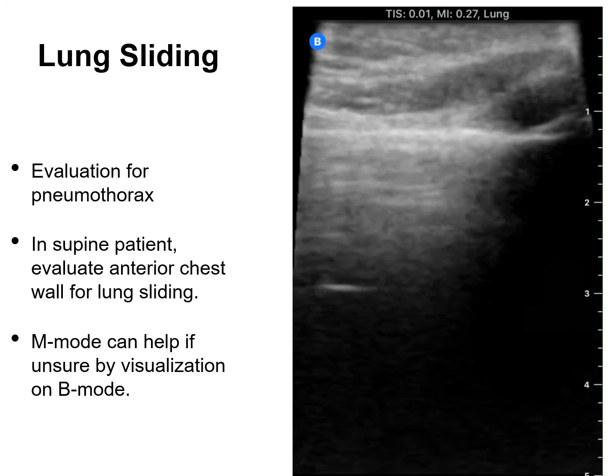The idea with the E-FAST patient is that any significant pneumothorax will rise to the anterior chest wall in a supine patient. And so if you evaluate each lung anteriorly, you will be able to find significant pneumothorax at least as well as, but probably better than, you do with the portable chest x-ray that every trauma patient gets.